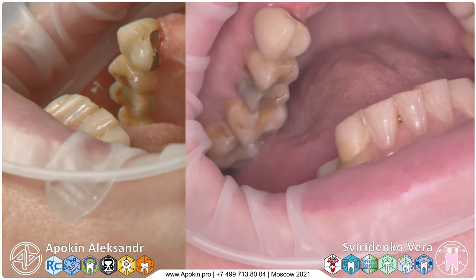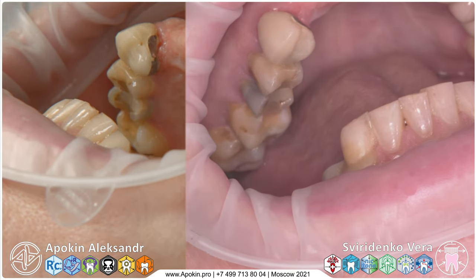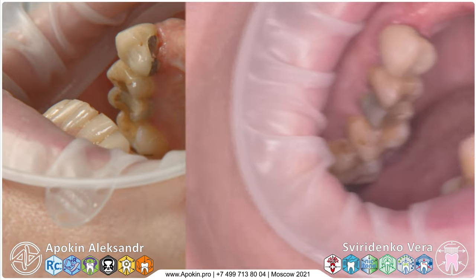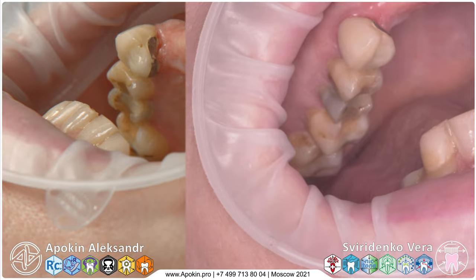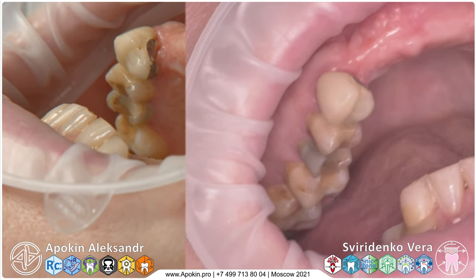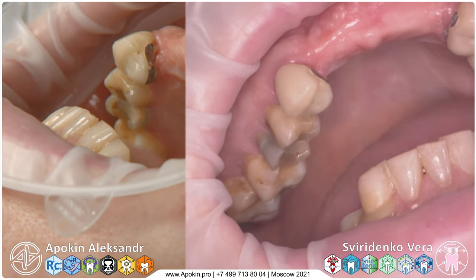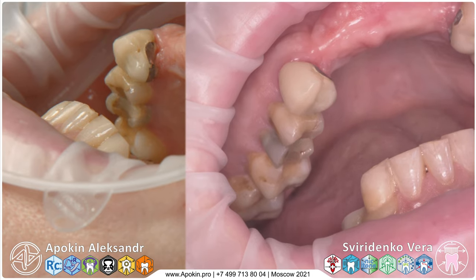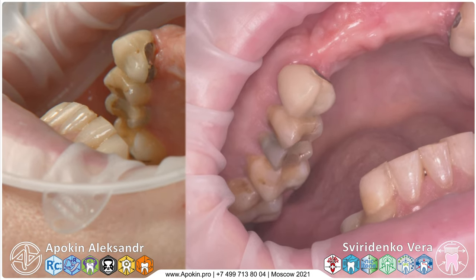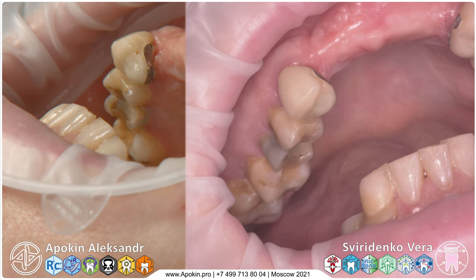enough space between perforations, because it is very important to have very good isolation in the interproximal space between teeth, between their crown parts. If so, you will not have any additional saliva, water, or blood during your work, and you can use any adhesive system in very good conditions.